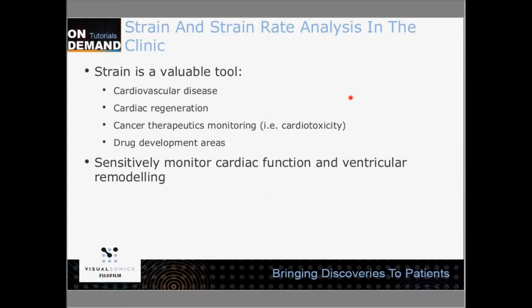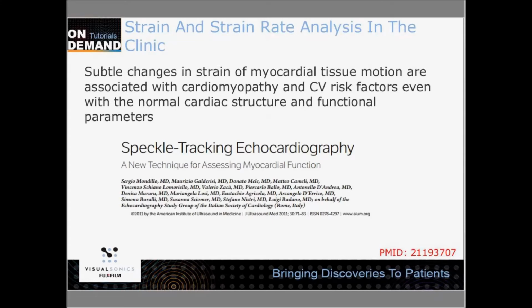And over that time, I think around 5 or 6 years, that we've had the application available, we've seen a very steady increase in interest, in use, and in papers being published, and really interesting results being teased out of the studies that our customers are doing. So this is just an example of what you might see for publications on the clinical side. I should mention, wherever possible, wherever we talk about a paper or a publication, I've tried to add the PubMed ID number, so that if you're following along, taking notes, and see a paper that you want to look up really quickly, rather than trying to jot down the author's name and the title, just jot down the PMID number, and you can pull the paper out of PubMed fairly quickly and easily.